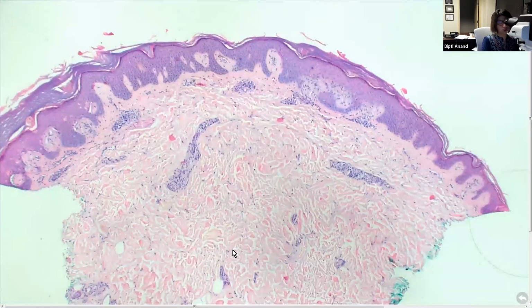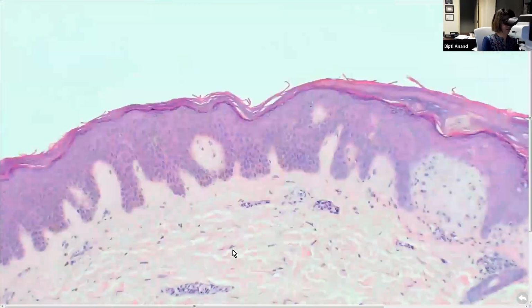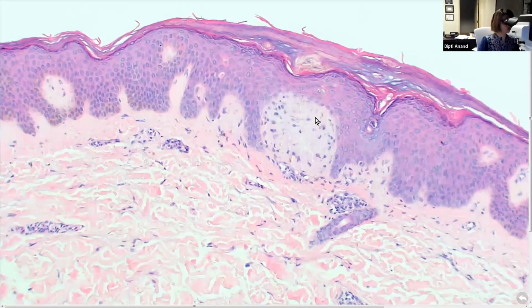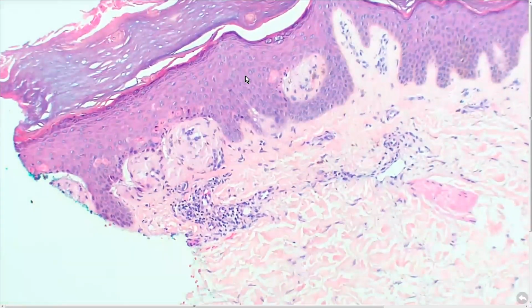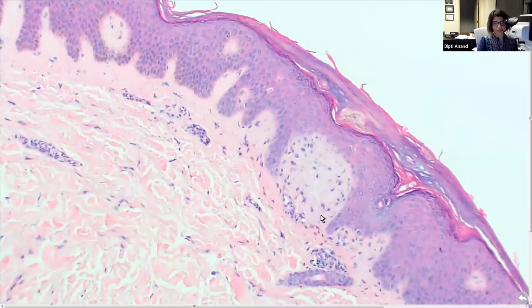What's happening in here? I think there are too many nuclei for it to be amyloid, and it looks kind of blue. Oh, it's turning out to be blue over this, but it's really pink. Okay, so amyloid. Yep, this is an amyloid. You can actually see the thick epidermis, thick cornified layer, and you will see cell death with it because that's the pathophysiology. And you can see the nice deposition of this pink substance. This is all amyloid.